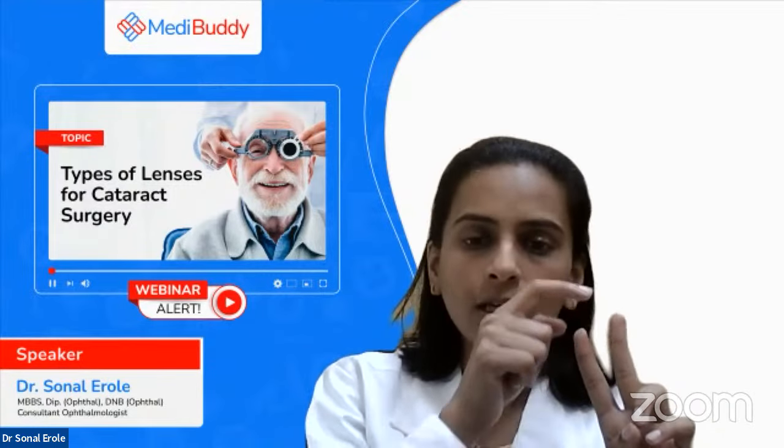But these lenses do have their own little bit of side effects, something we cannot match with the God-gifted lenses. They can have a problem in night driving. They can have a little bit of problem in contrast sensitivity. They can have photophobia. Photophobia means light sensitivity is more when they are going into bright light. So these problems can occur with multifocal lenses, but they do have the advantage of not using glasses.